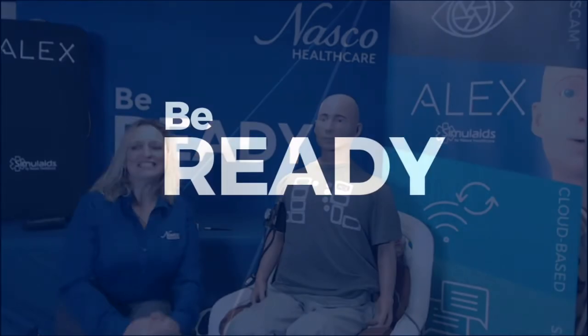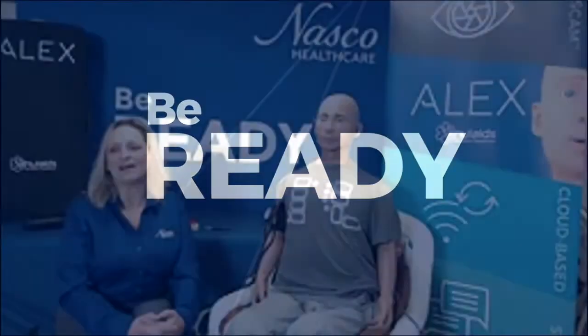Welcome, everyone, to Nasco Healthcare's beloved simulator. We're very excited to go over everything with you and let you see what Alex can offer. First, I'd like to start with his head to toe. From his head going down, on his right eye, you're going to have a camera that allows you to have patient perspective, from where the patient sees everything coming at them, conversation, facial affect, and everything.